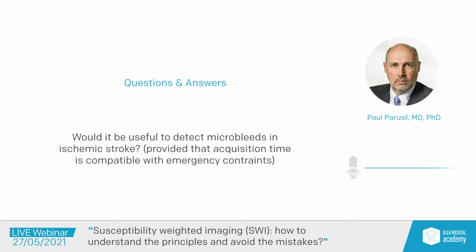I'm not sure. Here in Australia, there's a strong aversion to use MRI in acute stroke patients because there are not enough MRI systems to be available 24/7. So the question here is almost of no importance. But I know that in many European countries, and especially in France, there are increasingly hospitals with 3 Tesla MRI systems in the emergency room waiting to play a role in stroke.